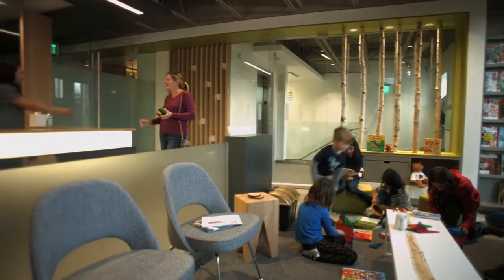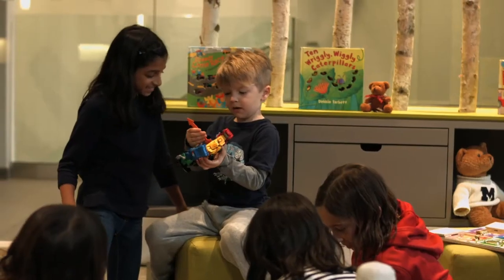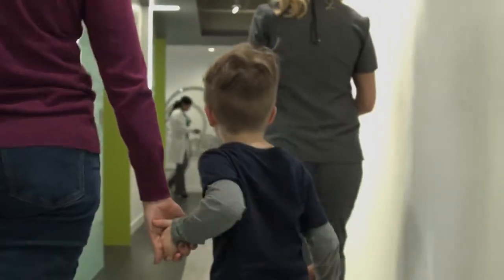At Dentsply Sirona, we know patients come in all sizes, so we create products that fit not only your practice, but your patients as well. This includes your smallest of patients.